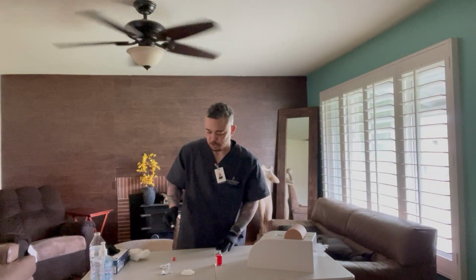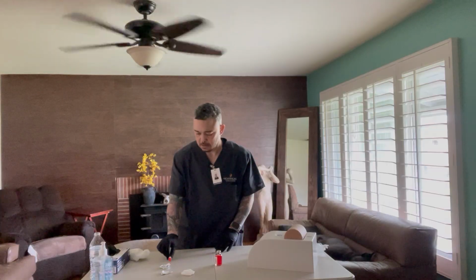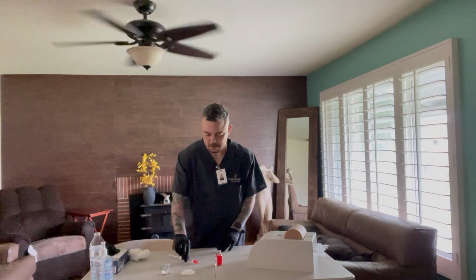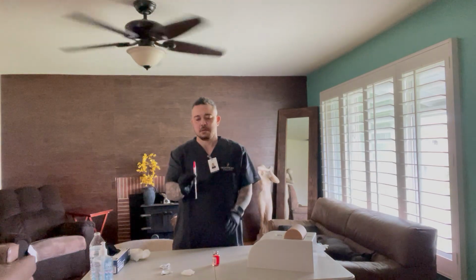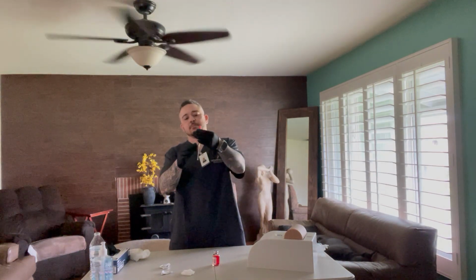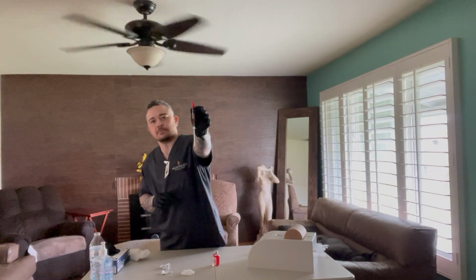I'm going to use a one-handed scoop technique. Put the cap back on. And as you can see, I have 1 milliliter of heparin.